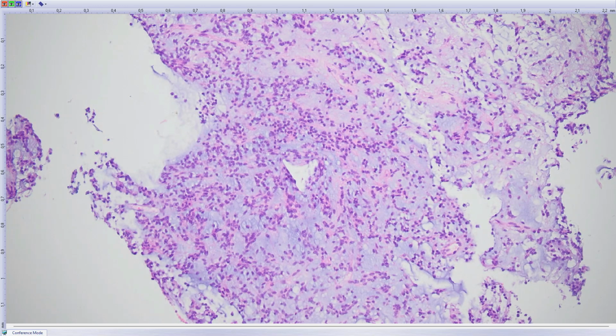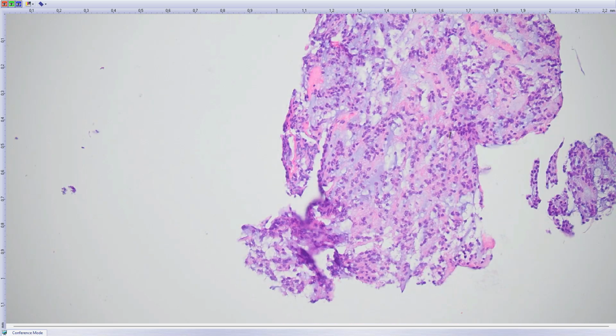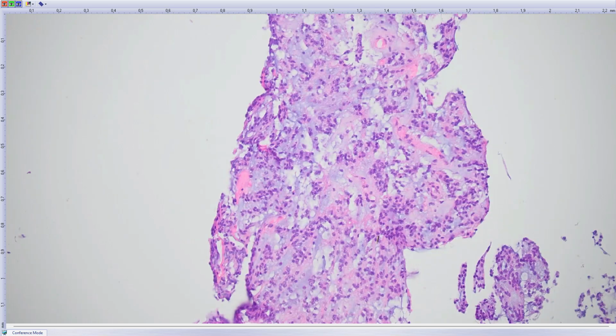Not that bad atypia, no mitotic figures were present, no necrosis. The proliferation activity was very low, and it came with a differential diagnosis, and they performed some genetics, especially KIAA1549-BRAF fusion. They tested for that, but it was negative, so that's why they sent it here.